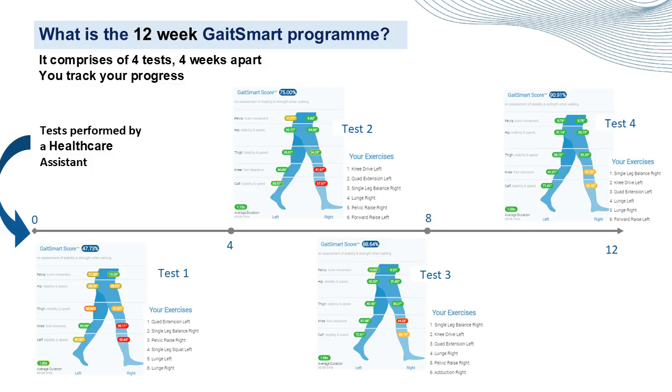So the focus now is on the right knee. Third test, it's getting better. The right knee's got an amber border and the calf is higher. And the fourth and final test is amber. So the thing is that we can see here, we've got this movement and the patient, the person can see this.